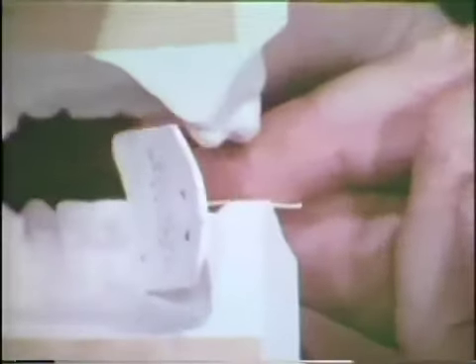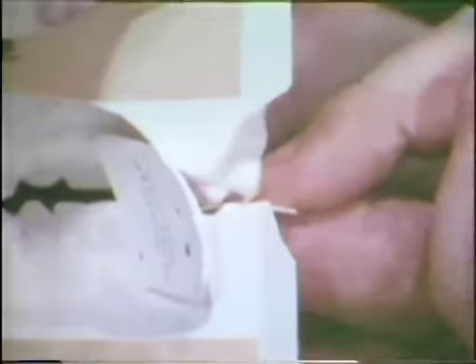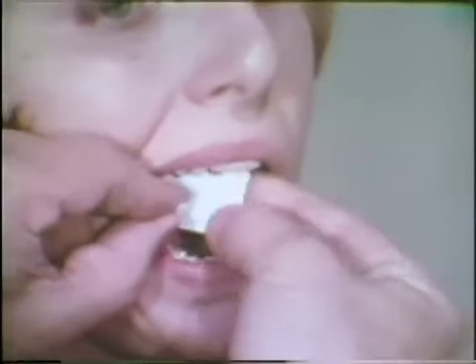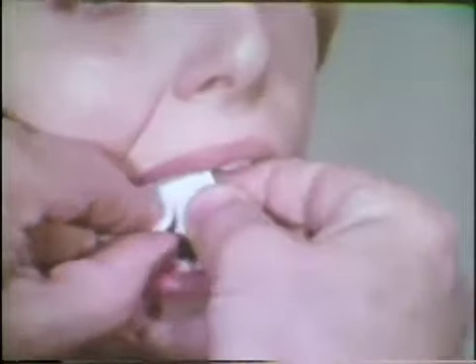We now view the same procedure from behind the models. The horizontal insertion, rotation into position, maintenance of position during slow closure, and now ready for exposure. Removal of the film is merely a reversal of the procedure. Utilizing the same principles, the film packet is now inserted into the mouth of the patient.